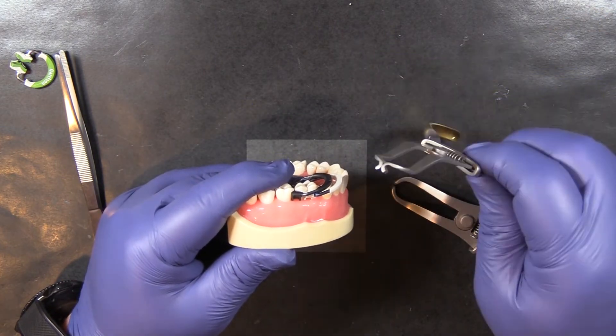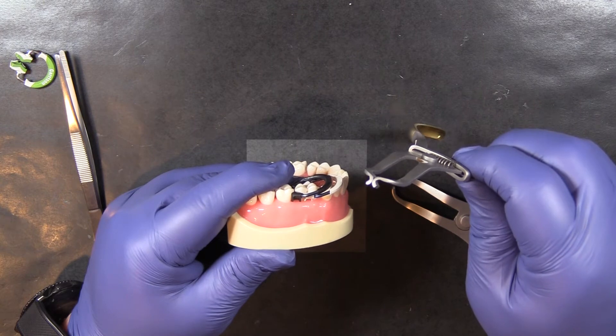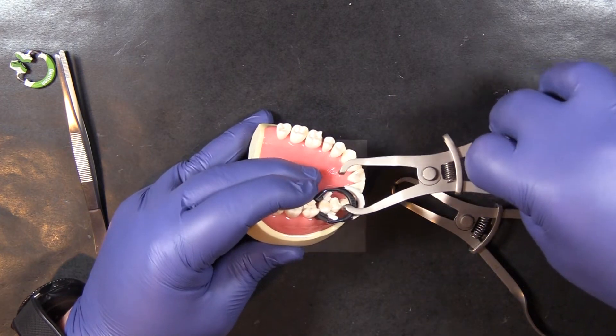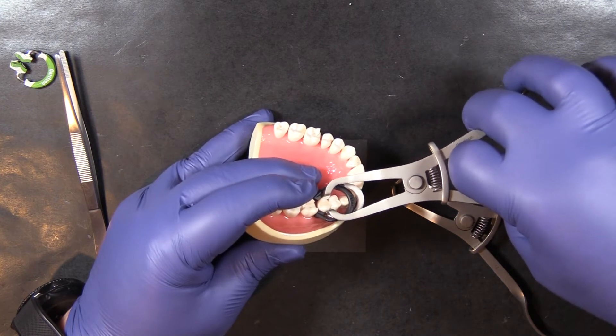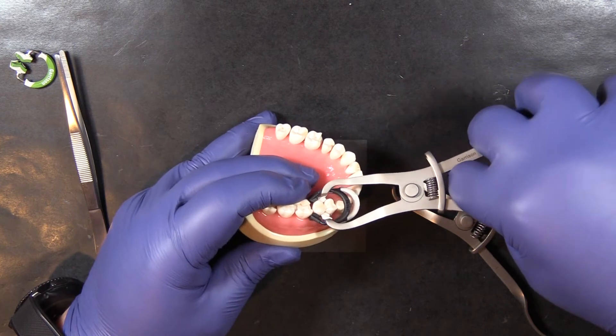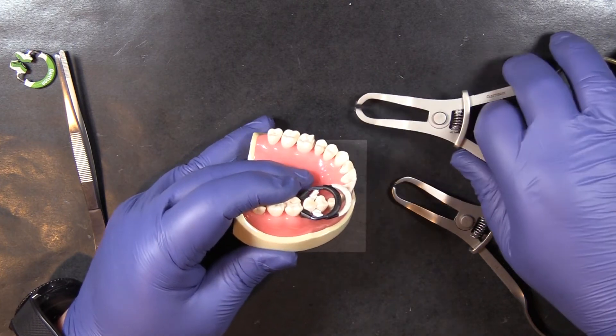What can happen with a Garrison regular ring forceps is when you go to remove the ring, you can get caught on the ring underneath it, which just makes it hard to grip. You actually end up trying to grab both rings at the same time.